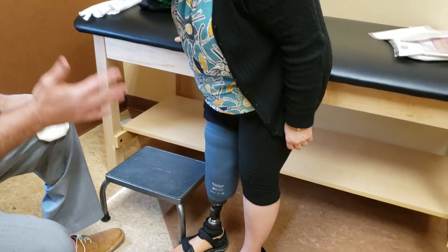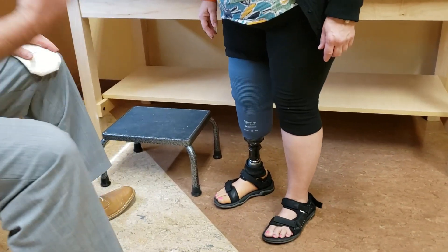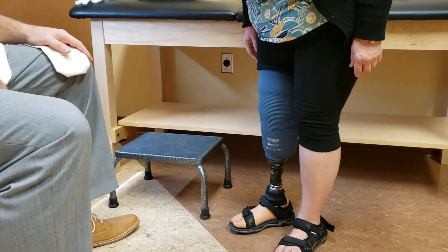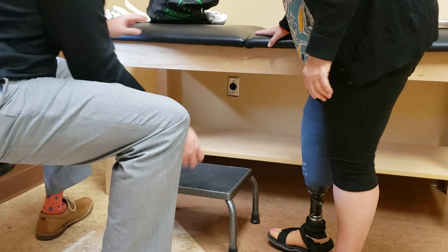Go ahead and do a few weight transfers — back to the right, back to the left. I would recommend doing this before you take off with your steps in the morning so that you feel secure within the prosthesis. As a pro tip, let's climb back up on the table.